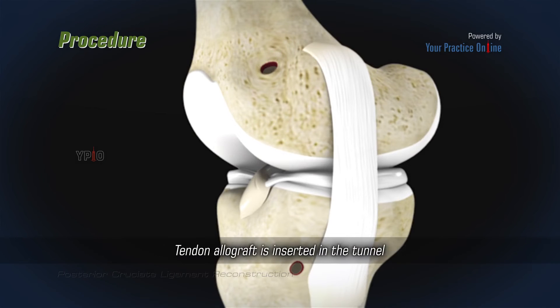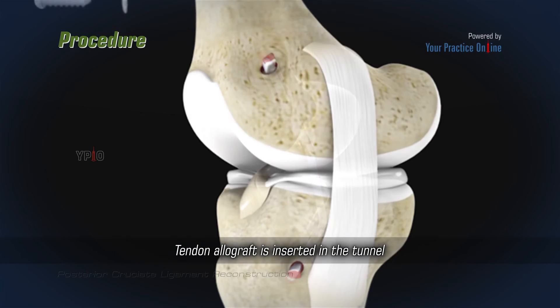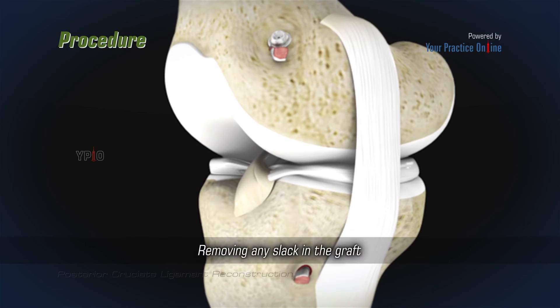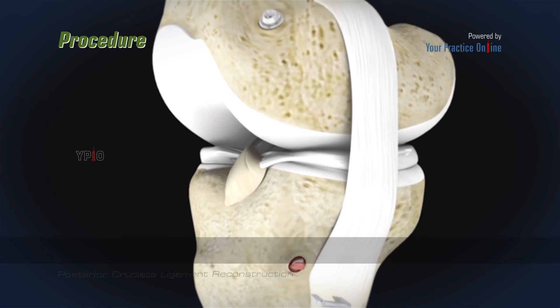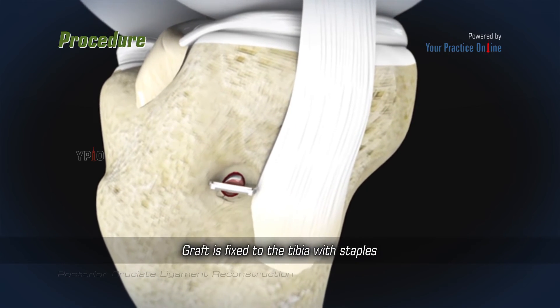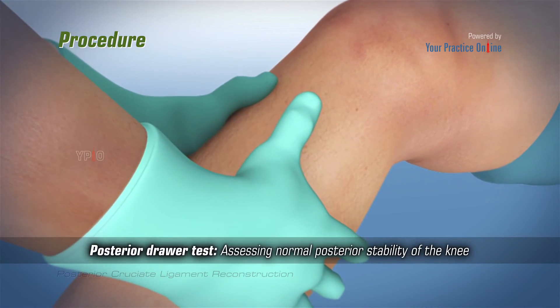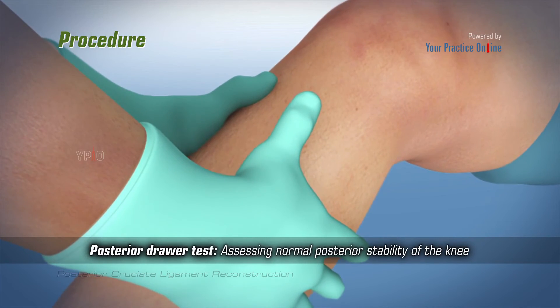The sharp edges and soft tissues around the exit site of the tunnel are smoothed with a rasp. The tendon allograft is inserted in the tunnel and fixed with a cannulated interface screw. The graft is made taut distally by removing any slack in the graft, then fixed to the tibia with the help of staples.